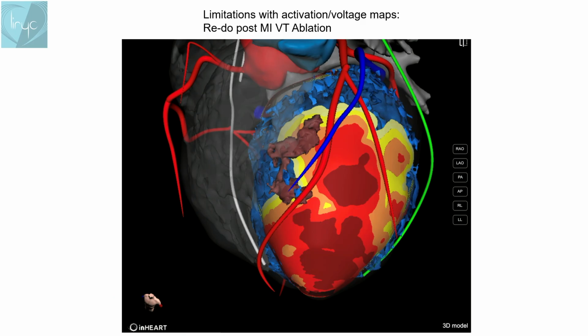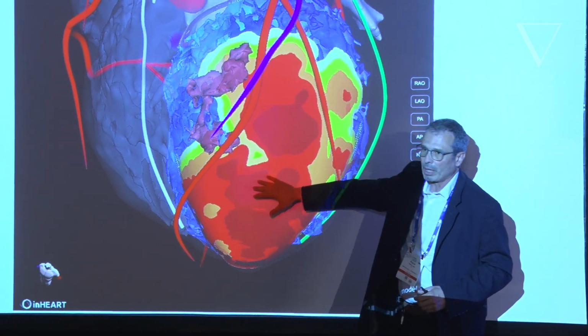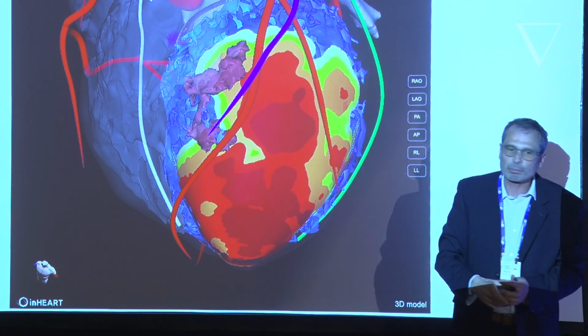So this is a very interesting case that was done in Germany. The patient had 2 ablations because he had recurrence after the first one. Now, the first one is shown in brown on that slide. This is the scar due to RF ablation as from the late gadolinium enhancement with MRI, okay? It's very easy to differentiate from the myocardial infarction. It's way brighter. And they did a good job, in fact, because there is an isthmus that is right here, okay? Because this is going to act as a barrier, this is not a barrier, and this is your isthmus. From imaging, it's pretty obvious.